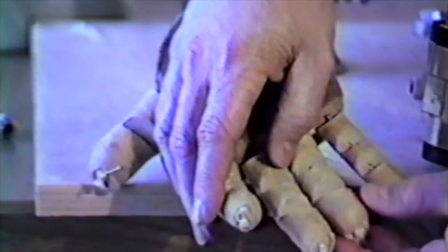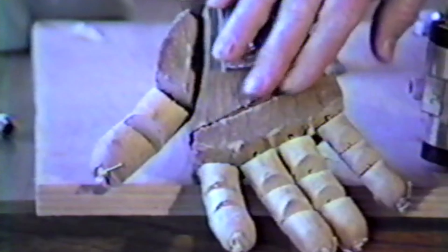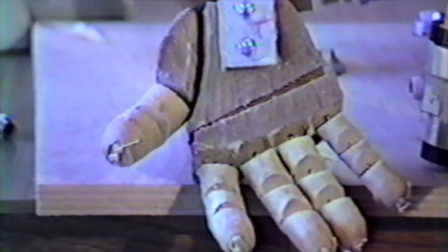Here I'm demonstrating what the hand looked like without the glove on it, so you can see a little bit better how it was made. It's a simple way to make these things — anybody could do it. It's like making a puppet hand, basically. If you pull the strings, it's a puppet; if you attach an actuator to it, it can become a robot or a prosthetic hand. That was my main interest at the time — making a prosthetic hand.